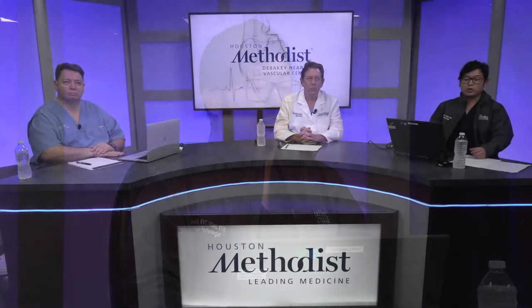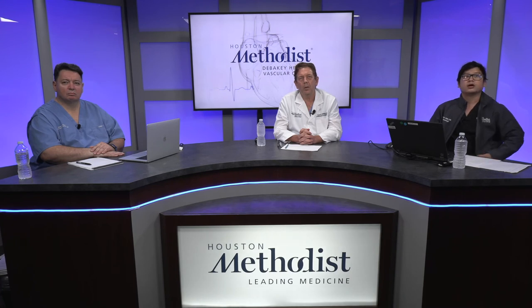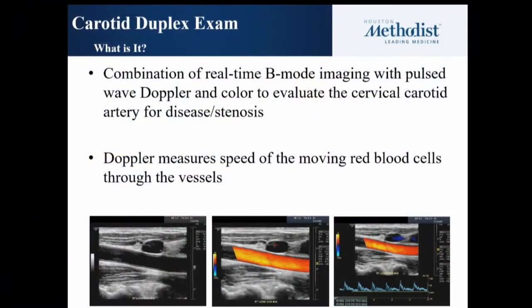We'll start with looking at how to do the carotid duplex exam. First, carotid duplex exam. What is it exactly? It's a combination of B-mode imaging and grayscale imaging with color flow. And through that, we can measure how fast blood flow is moving through certain segments of the vessel.